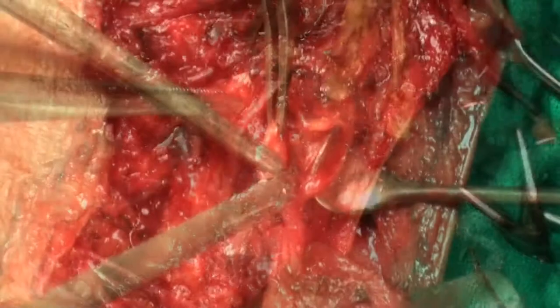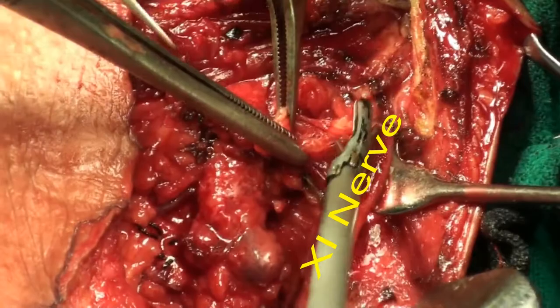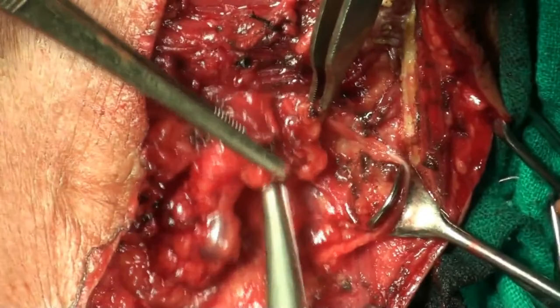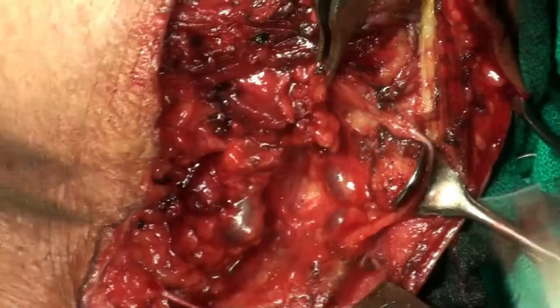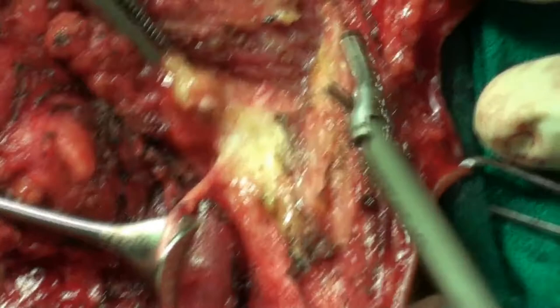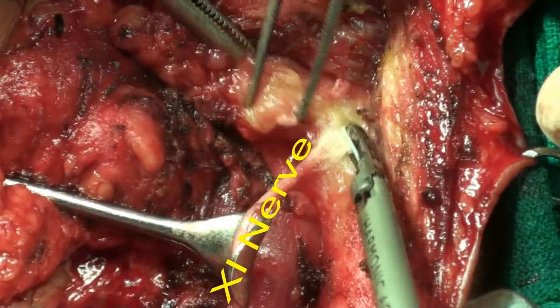I'll dissect them all if I can. Yes, this is here. Then bring the scissors now. Okay, open. In an old man, it's a big morbidity. See now the accessory is clearly visible. And I can get both sides. Very smart. Stopped at the right time. Very good. Come on.